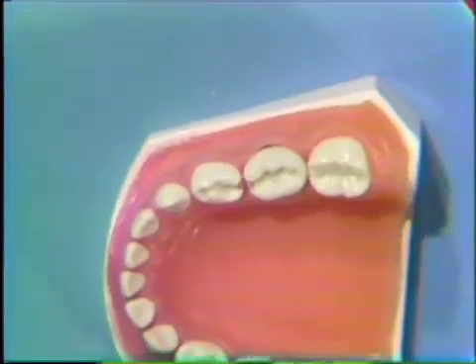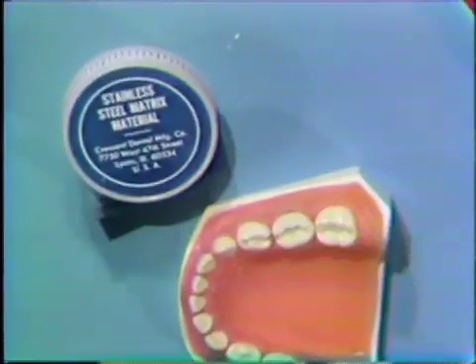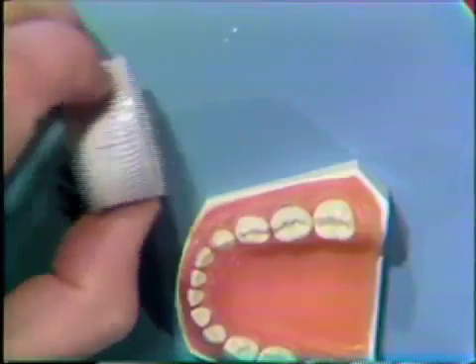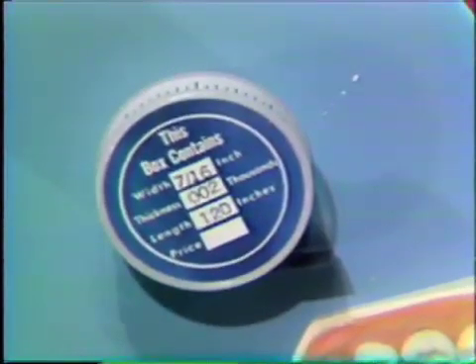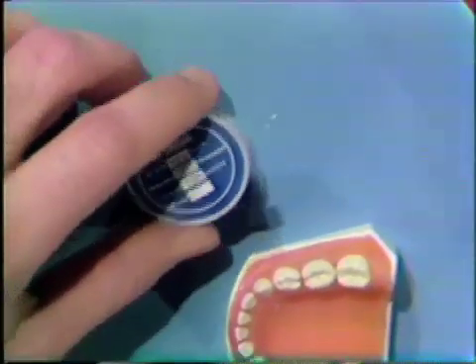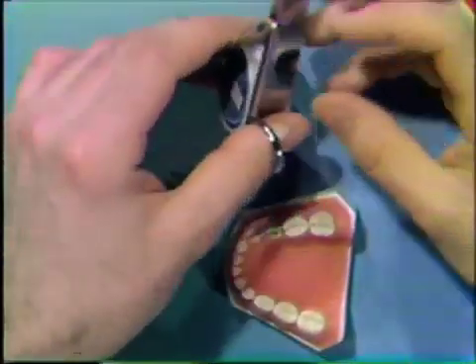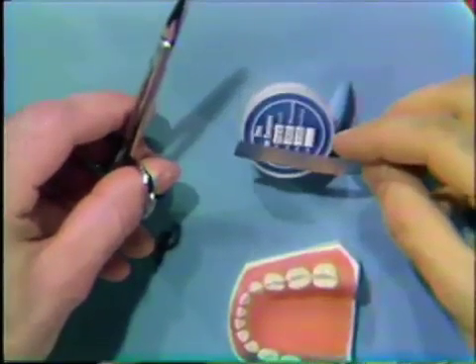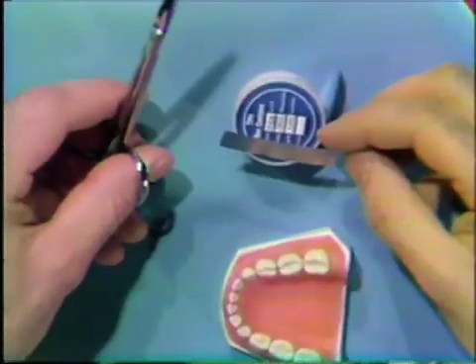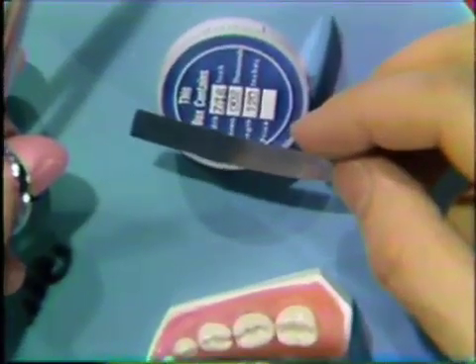This custom-made band is made with stainless steel bulk matrix material. The kind available in the clinic is 7/16ths by 2-thousandths inch thick. The first thing you'll do in the construction of this band is to cut a length of the matrix band material. The most common mistake is not cutting enough of the material. The 7/16ths inch width is really too wide, and since we want the height of the final band to be only a millimeter or two above the intended margin of the ridge, we will cut this band material almost in half.